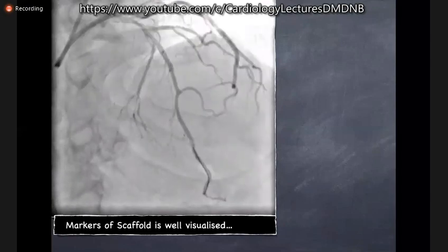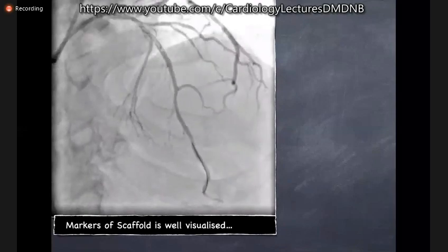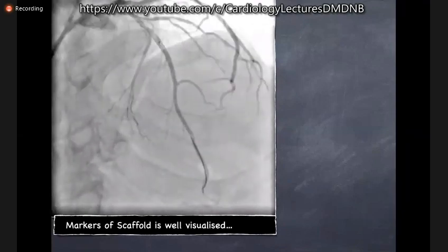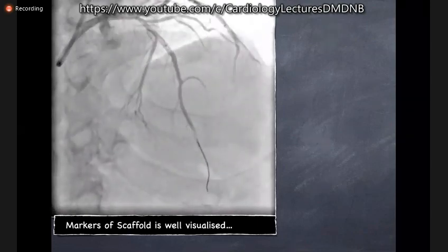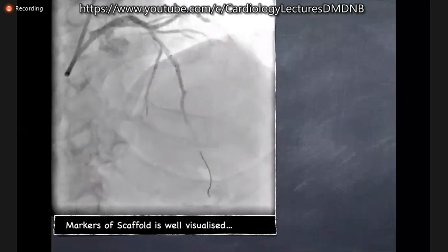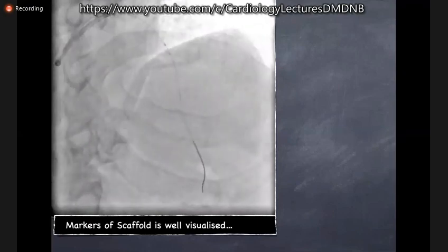Thanks to Meril, the markers are so good, you can easily pick them. You can easily make out that the scaffold has got dislodged, which was not really possible with the first generation scaffold. With the help of these markers, it was well visualized. So the next challenge was what to do next. We decided that we would deploy it over there and then have a 12 millimeter metal stent deployed proximally.